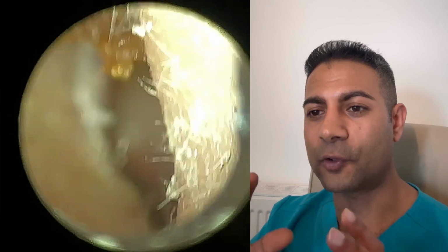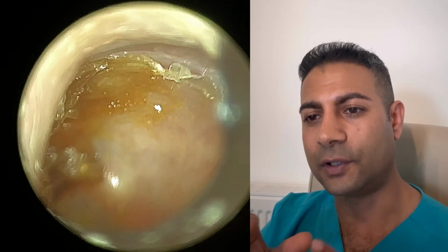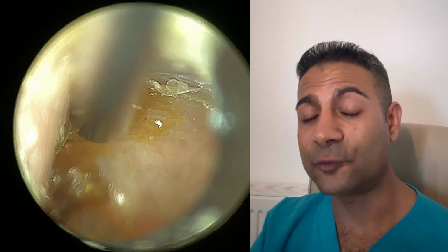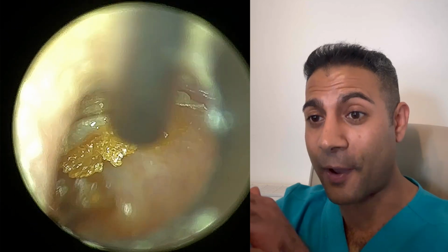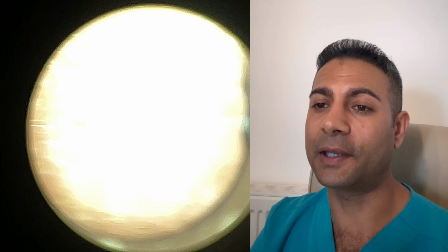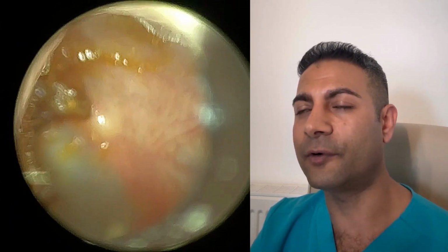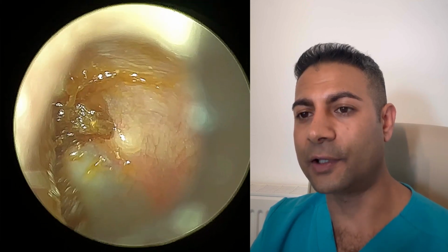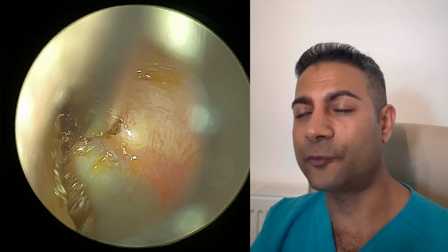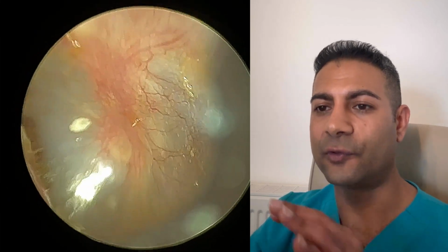And of course, when you've got a smaller speculum, you're going to see more of the speculum on screen. But when you zoom in, you actually eliminate some of that rim. Now, when you remove earwax using an ENT microscope or head loops, you actually see far more of the speculum. It's only with an endoscope that you don't see the speculum, because with an endoscope, you don't utilize a speculum. Although you do have specula for endoscopes, it's more for visualizing the inside of the ear rather than performing procedures. But by using a speculum with an endoscope, you're actually taking away from one of the USPs of an endoscope, which is its wide field of view.